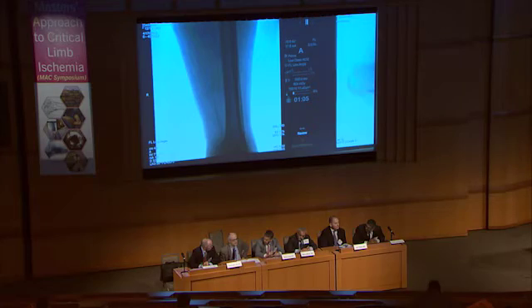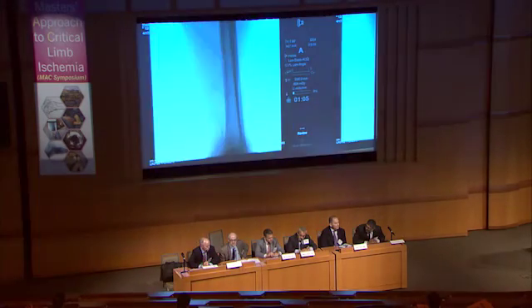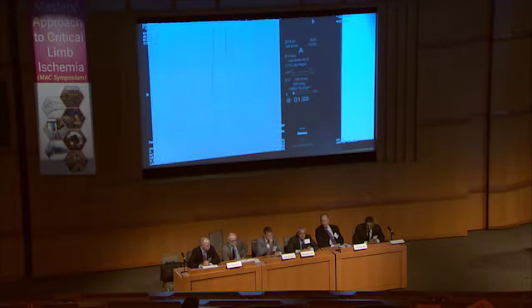So at the moment we have no drug-eluting balloon which has shown any benefit as compared to plain balloon. So we use drug-coated balloons in our institution only within study protocols or in really desperate cases where we believe we have no other option.